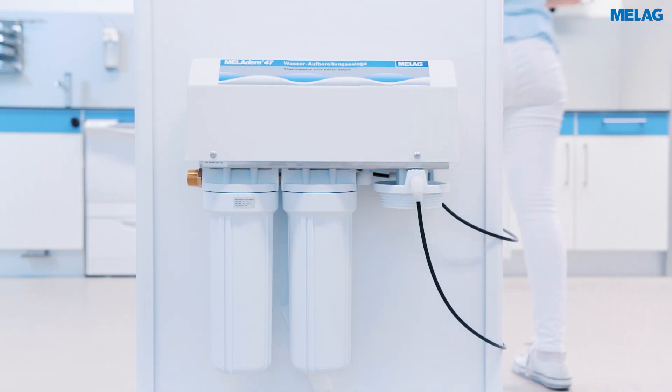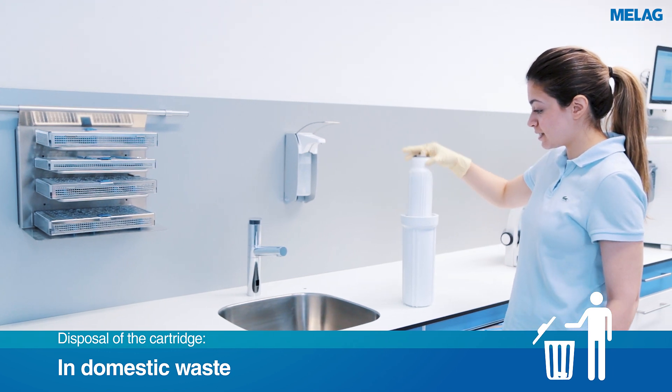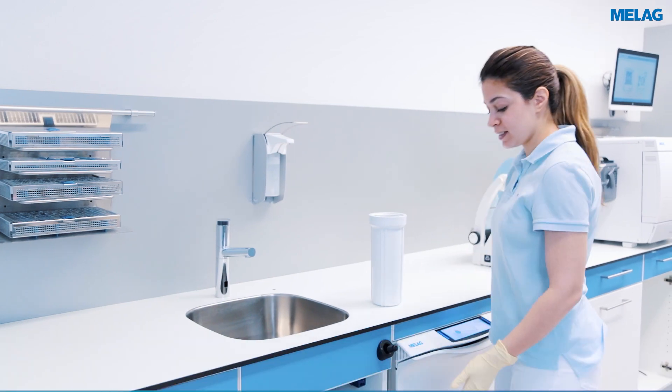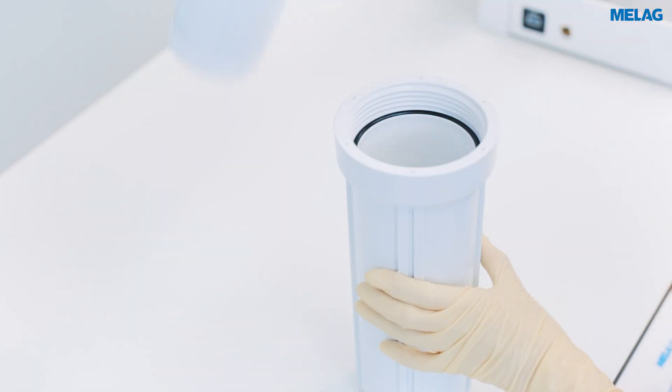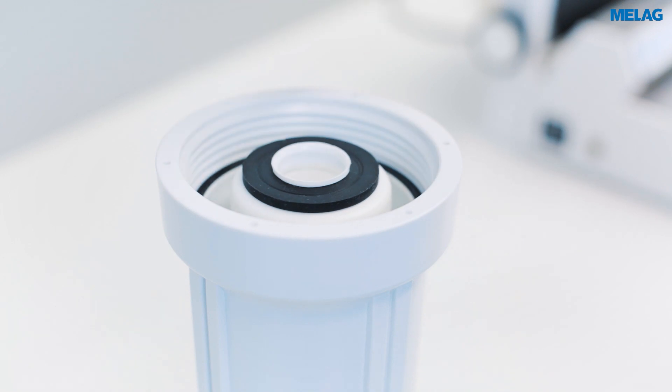You can dispose of the used cartridge in the normal domestic waste. When inserting the new mixed bed resin cartridge, please make sure that the flat seal of the cartridge points upwards.